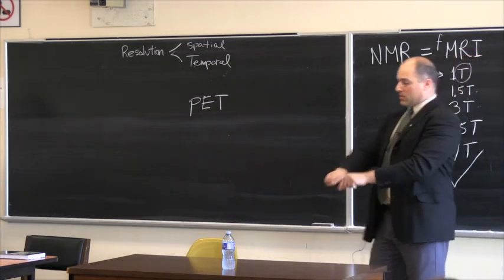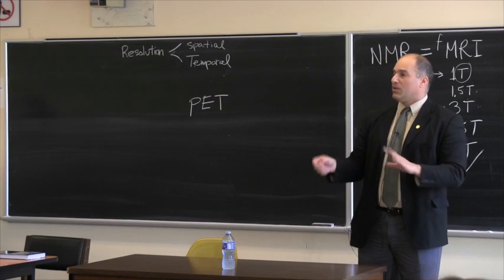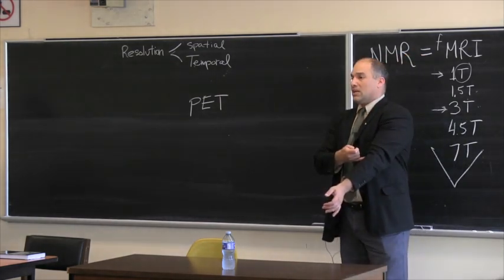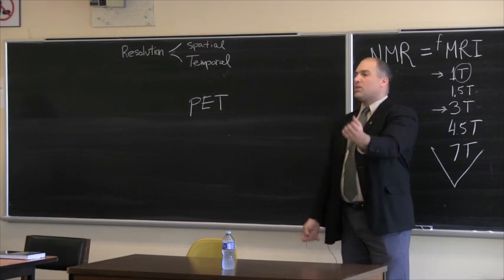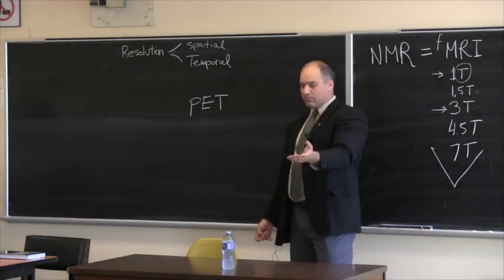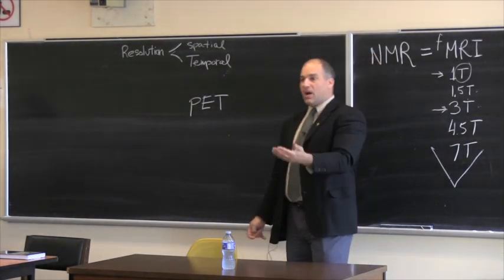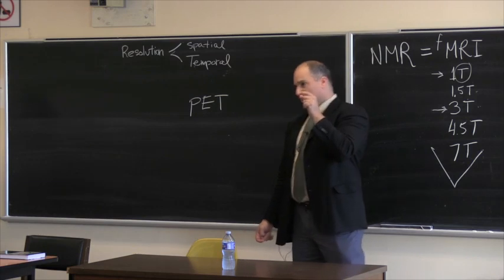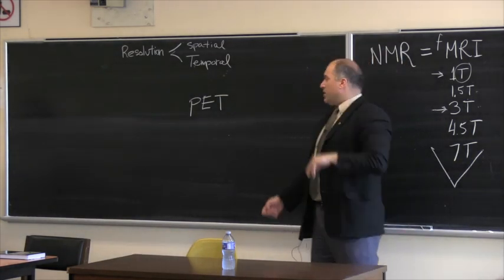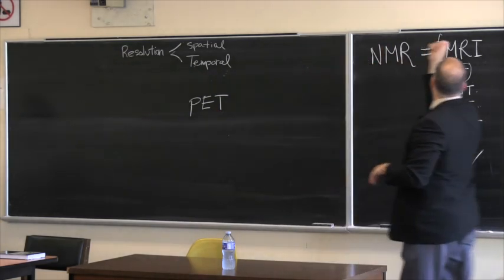It's a technique where you're still lying down supine and you're still going into a scanner and you're still in a tunnel. All these things are very true, but in addition to that, you need to have an IV line in. And in that IV line, you're getting usually some kind of a radioligand, a radioactive material. And that material, either radioactive sugar or radioactive oxygen, would actually bind, or would travel into your blood and go into your brain. And then we have all these, again, the same T. This T and this T are the same.